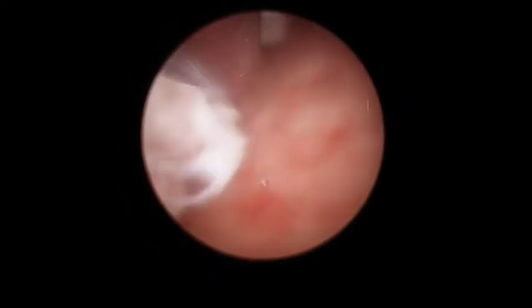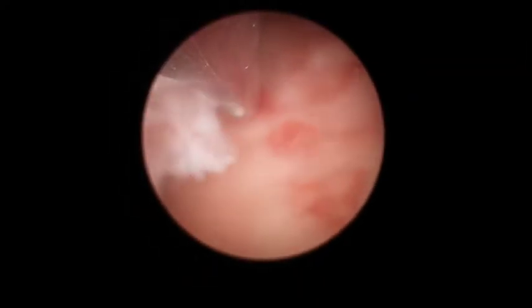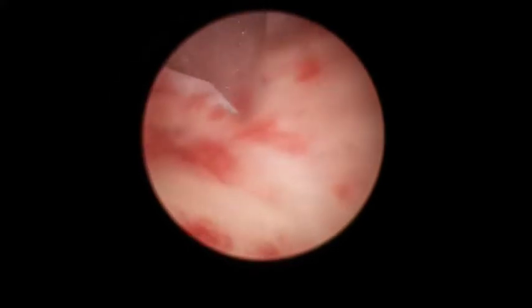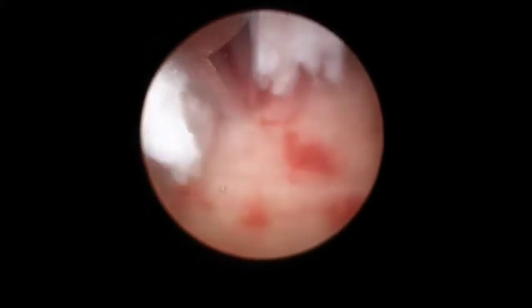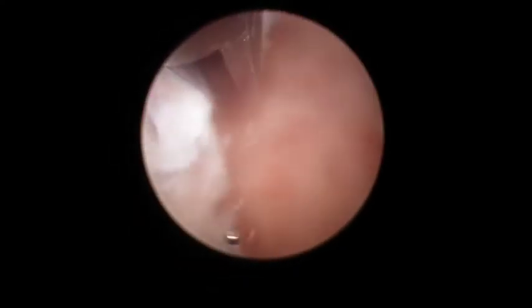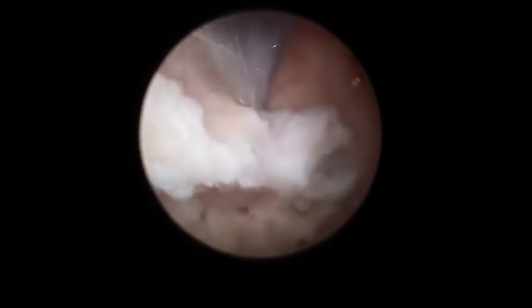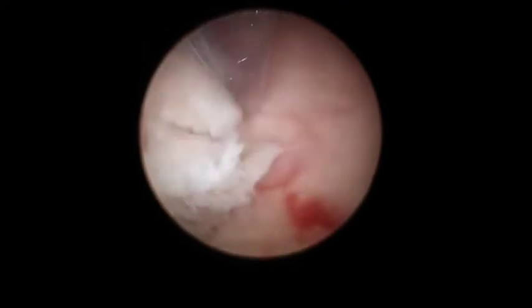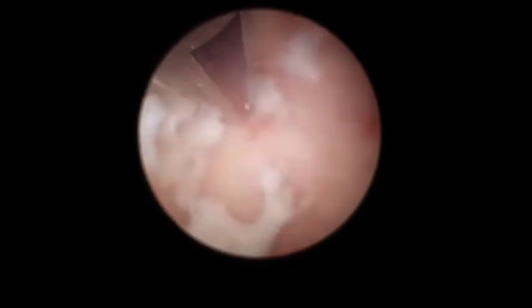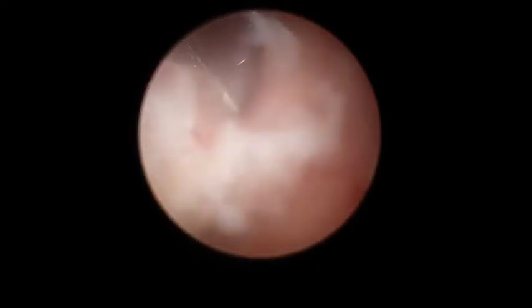The flow-by technique allows the operative field to be cleared and resection to continue on the anterior fibroid. The device is moved side-by-side systematically to resect the myoma. Hysteroscopic myomectomy is the ideal procedure for patients with symptomatic submucosal fibroids — it is safe, cost-effective, and has high patient satisfaction. However, it is an operative challenge to achieve complete resection while avoiding complications including cervical injury, uterine perforation, excessive fluid absorption, and bleeding.